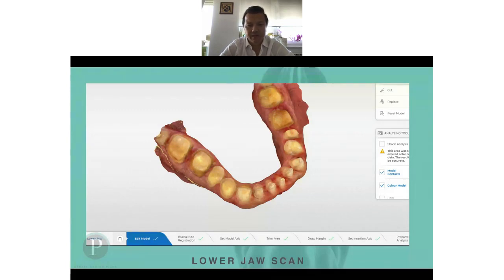But as I mentioned a few times today, it is unnecessary to prepare the tooth from the oral surface because the tooth looks very healthy from this oral side. According to modern dentistry, with good ceramic materials and cements, it's unnecessary to prepare the whole tooth.